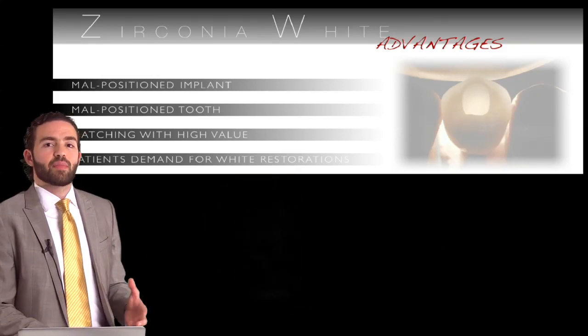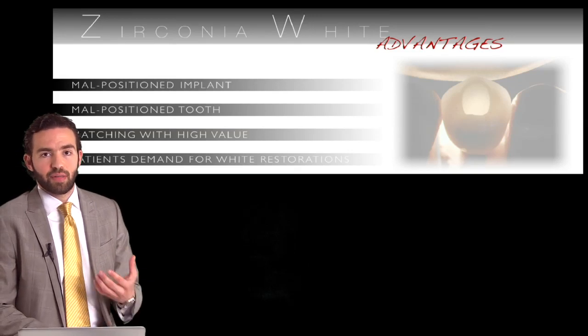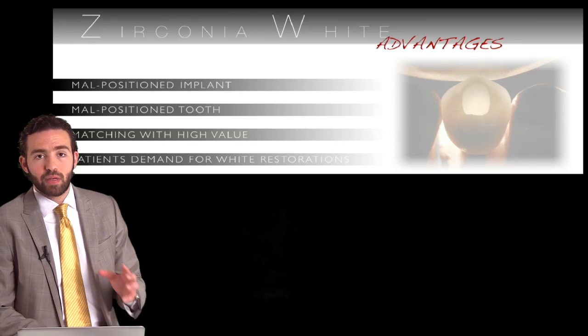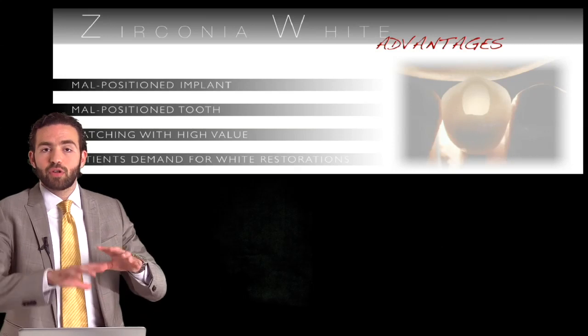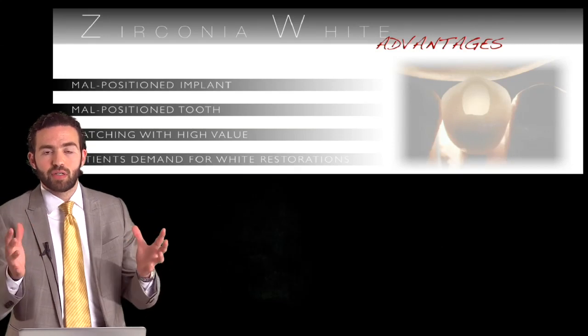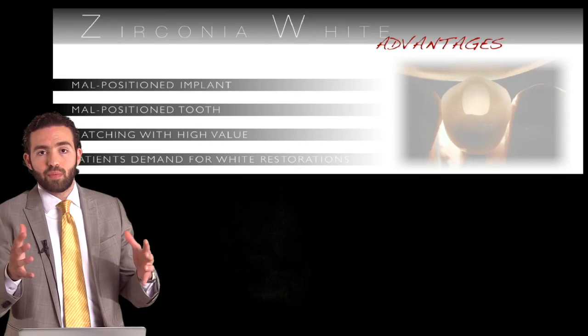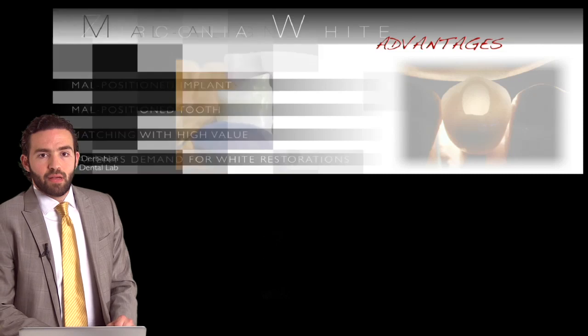And patients demand white, pasty white restorations, especially on the posterior molars, as Mamali has showed earlier with the one body high strength materials, where you can use a full contour posterior restoration made through and through out of zirconia.